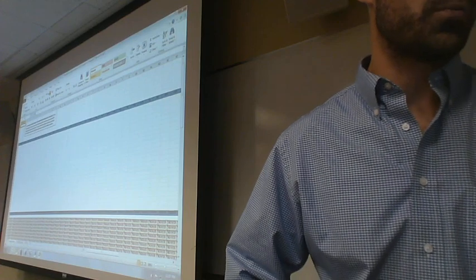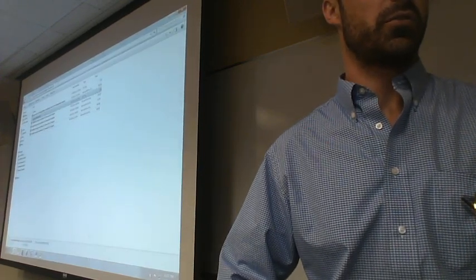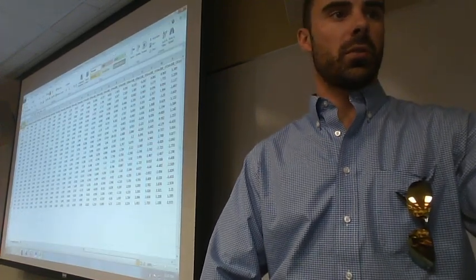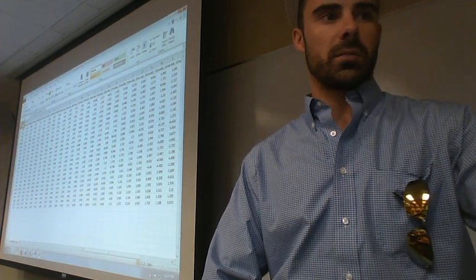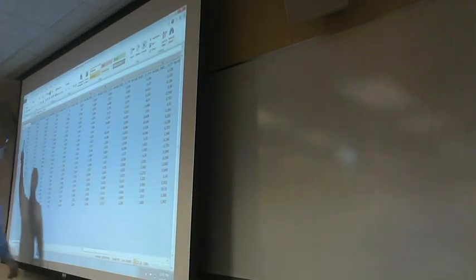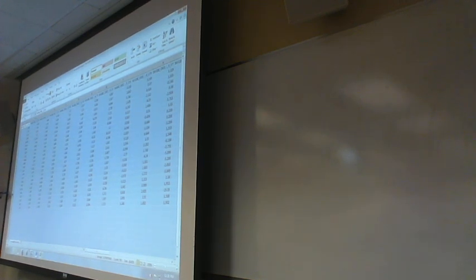Okay, let's open up our stat output file, which here is this raw amplitude output. What this is, if we grab all of this, is that difference wave. So it tells us it's bin 188 for the subtraction between old 5 and old 4 responses at electrode site FP1, at electrode site AF3, at electrode site F7, F3, FC1, and so on. Okay? So, for each of our subjects.